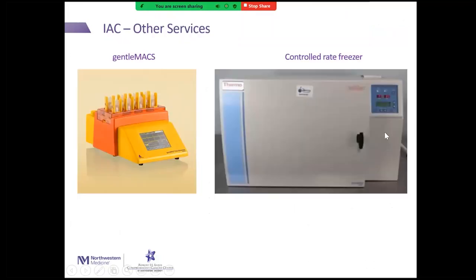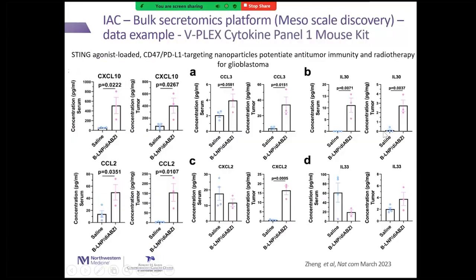So you can really get good data from these multiplex cytokine panels and find out in one go, with low volumes, what kind of proteins are secreted in your samples, and they can be very useful for being a biomarker for that particular kind of disease.